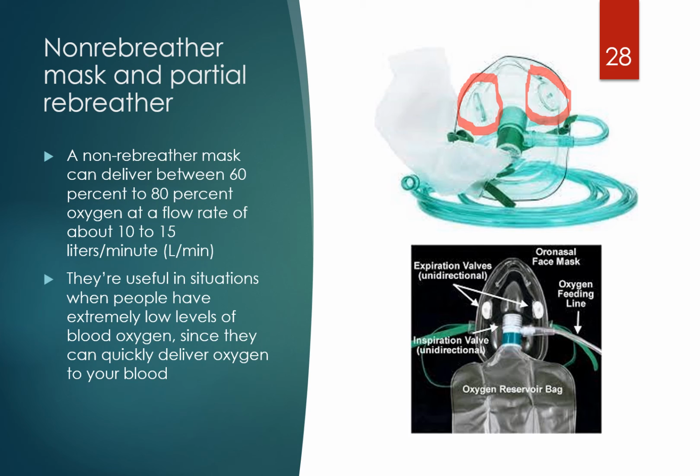So that's the difference between the systems, and this mask is commonly used in the emergency room, and we've seen patients, even with the COVID patients who are really going bad, we would put them on this. Obviously, high-flow nasal cannula has taken the place of this type of mask, but like I told you before, I'm not giving a lecture today on high-flow nasal cannula.